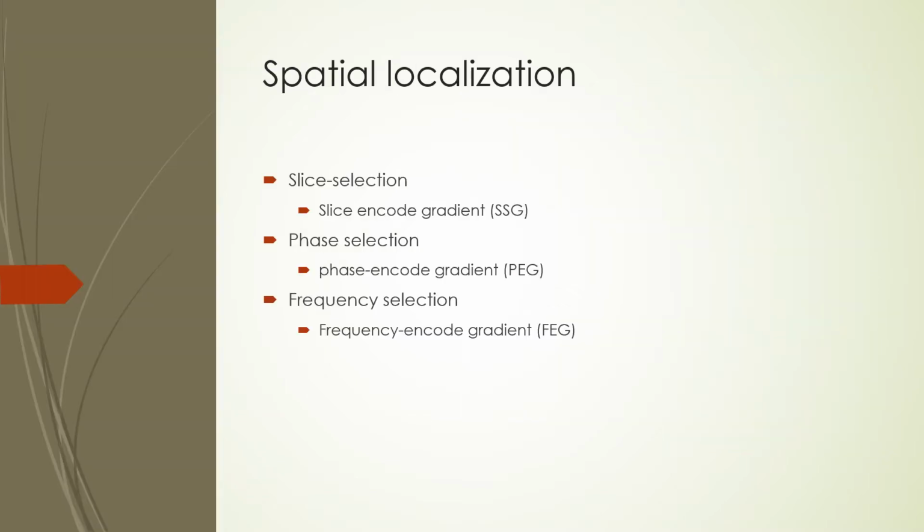Before we get into MRI localization, let me review for you how we localized in radiography and CT. In radiography, localization was done by simply reading out the locations of the detector cells on a digital detector matrix, and the signals in those cells were mapped onto a two-dimensional matrix for display. In CT, localization is done by first filtering the ray projections received by the detector and back projecting the signals onto a two-dimensional matrix. The difference in linear attenuation coefficients along each ray was used to create Hounsfield unit maps on a two-dimensional matrix. In MRI, spatial localization is done by 3 gradients built into the machine.